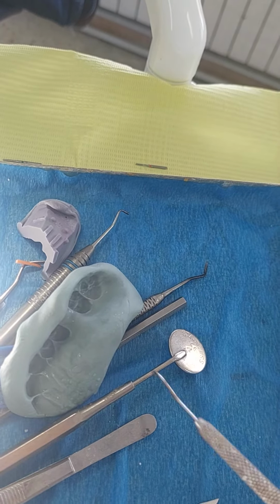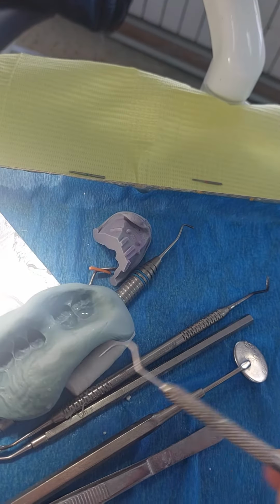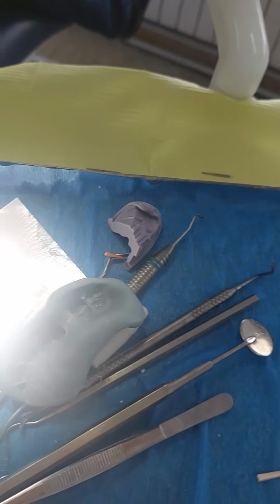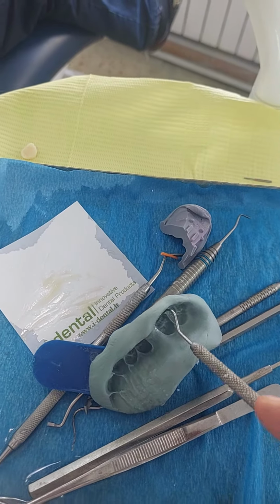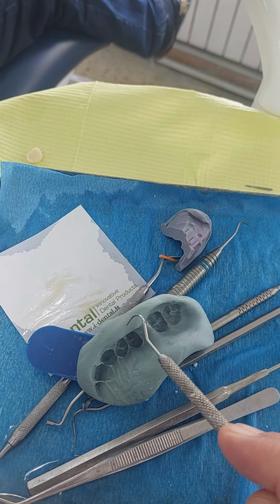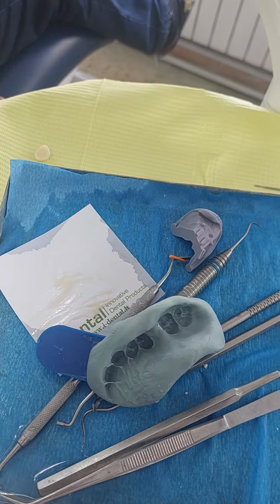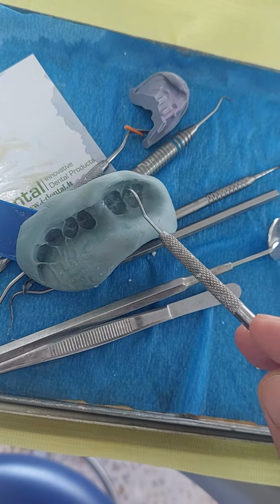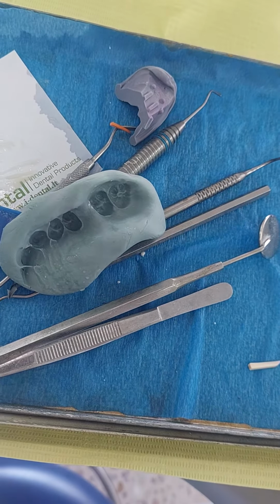Okay, so you talked about the patient's limited mouth opening, but this is still a bulk to enter into the patient's mouth. This might have prevented. Suppose you have touched, for example, while you were working, you have bumped into the cheek, or bumped into the tooth with the buccal tissue. What will happen? This is not seated. So this is a good case where the index was not correctly seated, so we had the occlusal surface replicated, but we don't have a space for the prepared tooth itself.